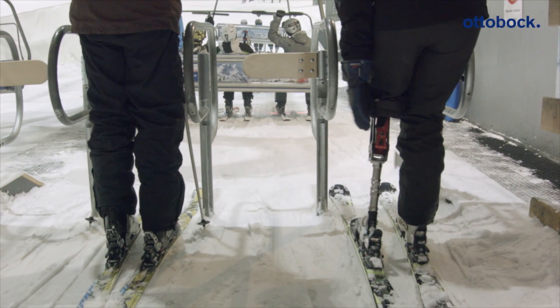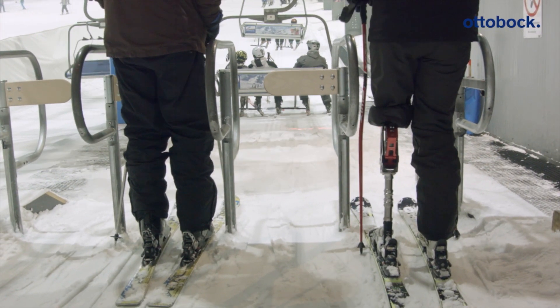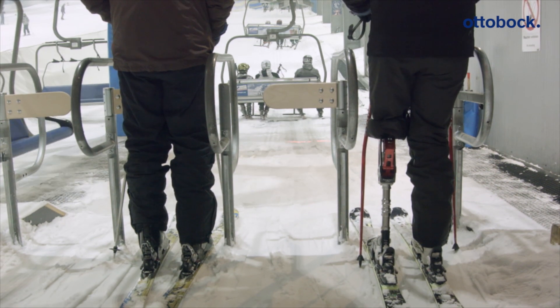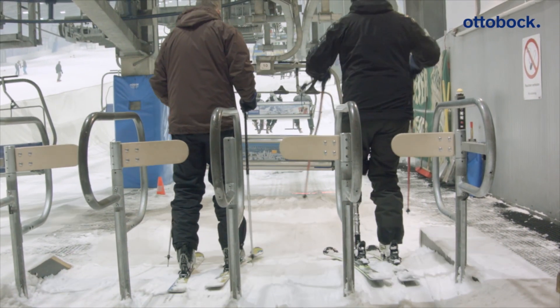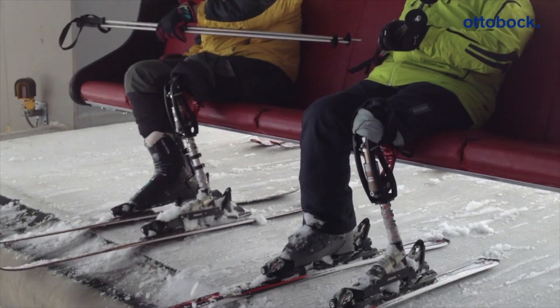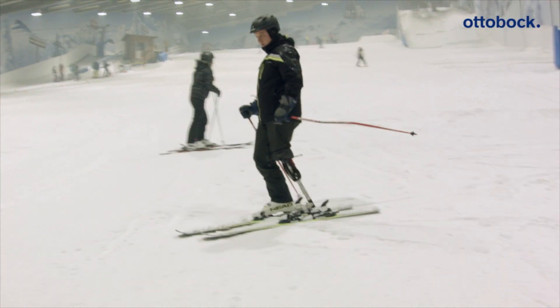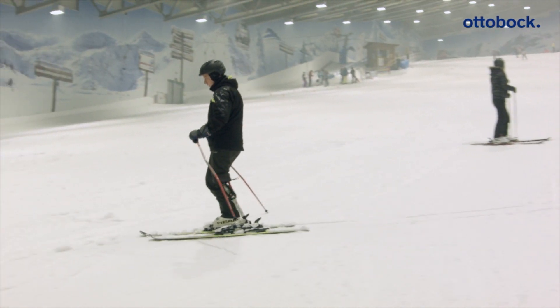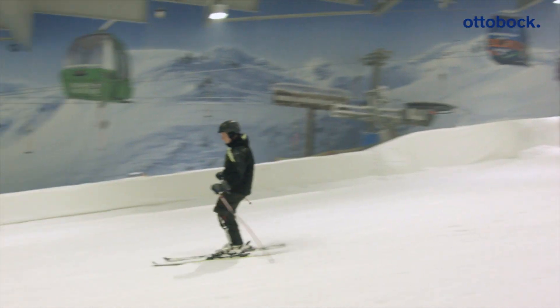The prosthesis knee can be unlocked for sitting down, which enables a chair lift to be used, for example. For standing up, the lock must be engaged again manually and checked to ensure it is engaged securely. The user can now try out the skis alone. Pro-Carve has been developed especially for carve skiing and no longer represents an obstacle.